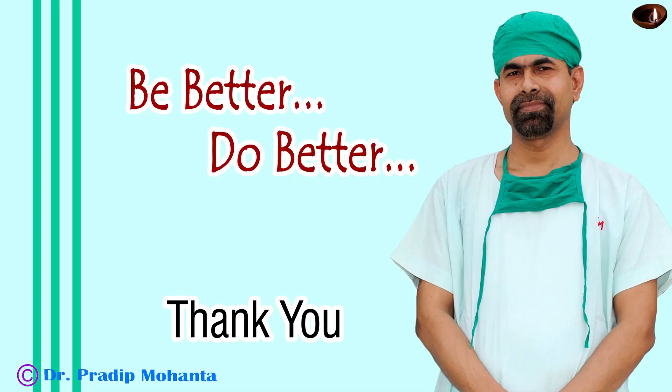Thank you very much for your attention. It is possible to do hard cataracts with our Indian-made machine. We should be proud of Indian companies that are making such good machines.